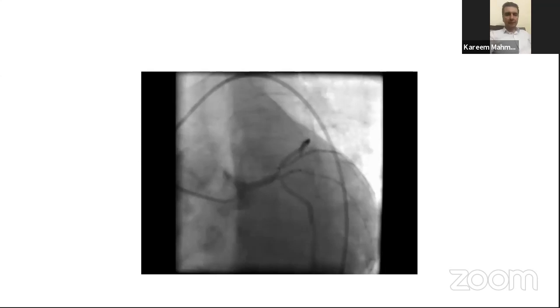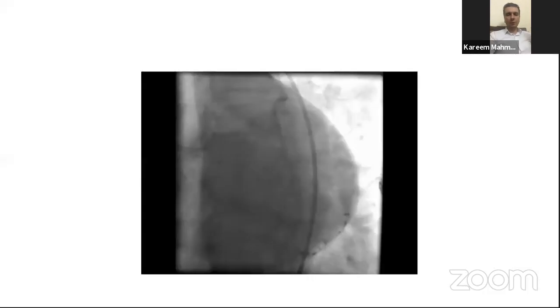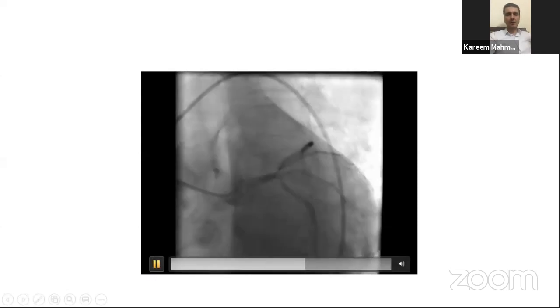To stress on the point Ahmed has mentioned, wiring every vessel involved in a bifurcation, I believe it's essential, because wiring helps to keep the vessel patent. You might have a pinching of the vessel, but if we have asymmetric flow with just a wire put in these important branches, you can end your procedure like that, keeping this small vessel patent. So wiring of these small branches involved in bifurcation is essential also.